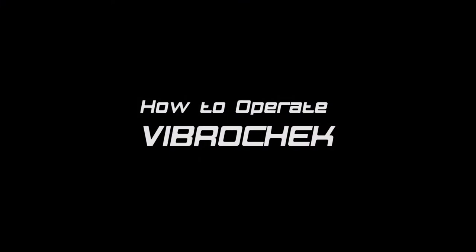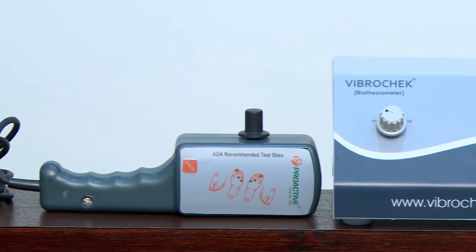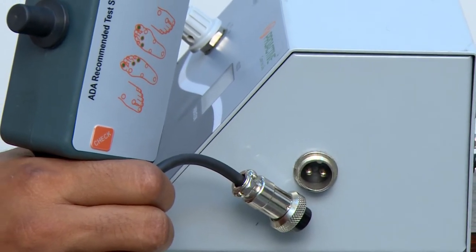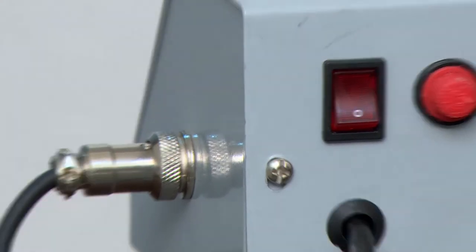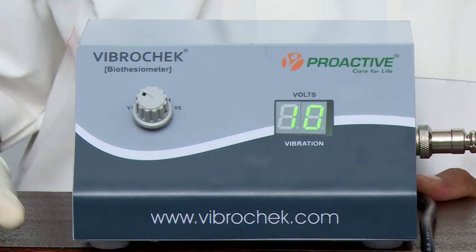How to operate VibroCheck? VibroCheck has two parts: the main machine and the probe with the handle. Step 1: Connect the power cable to the mains. Step 2: Plug in the handle cable into the main machine. The probe is now charged. Step 3: Switch on the unit. 10V will appear on the screen.